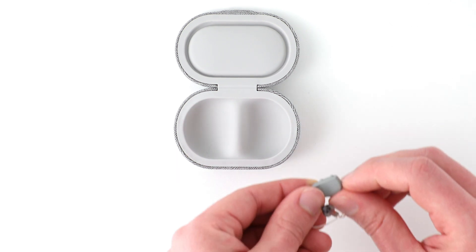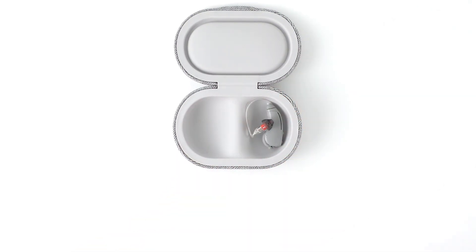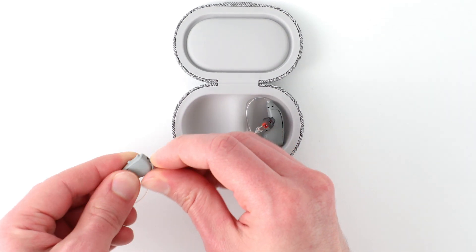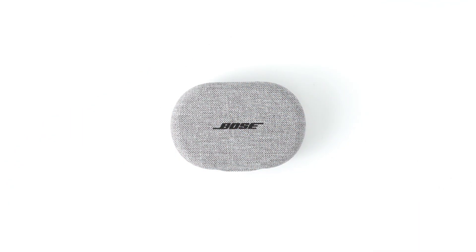When you're finished using the hearing aids, partially open each battery door until you feel a click. Partially opening the battery doors will power the hearing aids off, preserve battery life, and prevent the batteries from falling out.